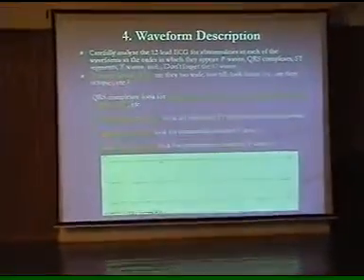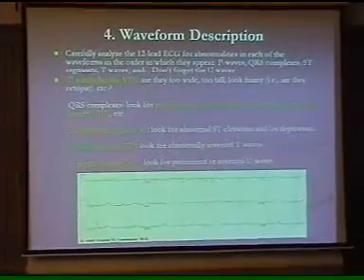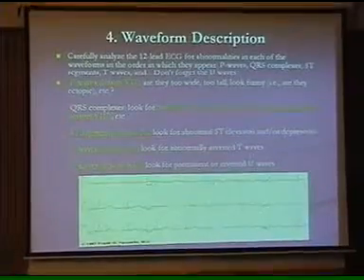How much? 10 seconds. So if you count the number of complexes here, 1, 2, 3, 4, 5, for example, there's a 1, 2, 3, 4, 5, 6, 7, 8, and times 6. So if it's 10 seconds, 8 times 6 will be your heart rate. 8 times 6 is equal to, or 9 times 6 is equal to 54. Yes?